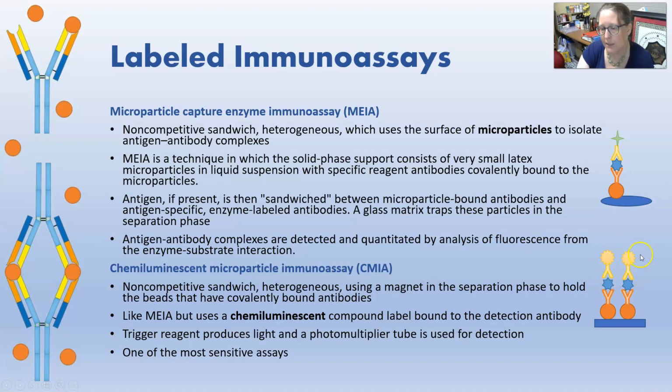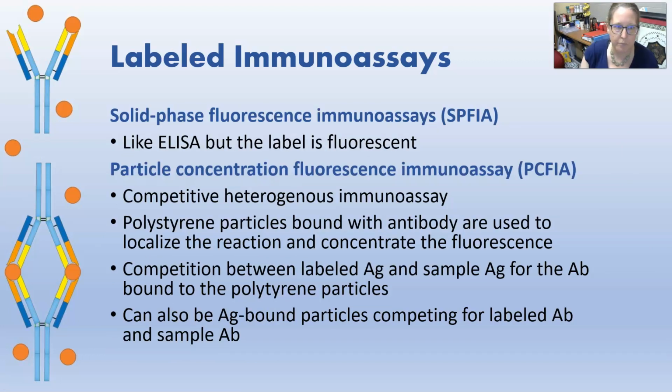It looks a little bit like it's glowing, but you would also have the trigger reaction. So there would be some wash steps in there where the magnet is going to hold these beads. And if there was no analyte, then in the wash step, everything would be washed off. You just would have the beads, and when you add these and then wash, there was nothing that would bind. So anyway, it makes a sandwich here, and once that sandwich is formed, you can add the trigger reagent, and then the chemical light will happen and can be detected.